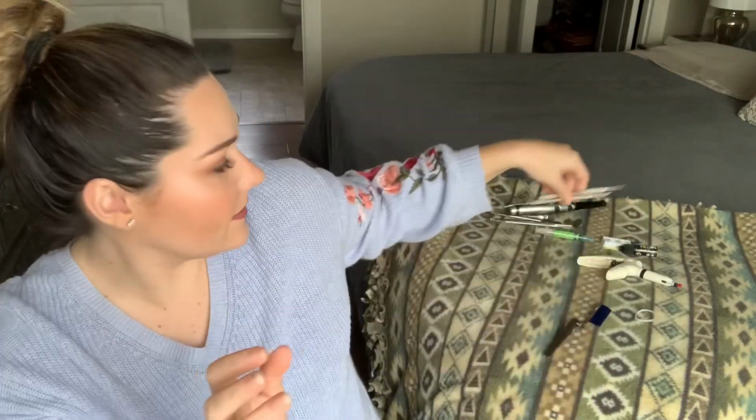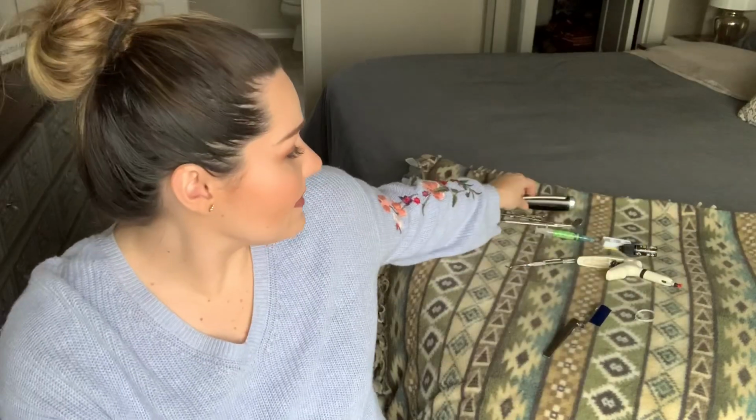So once he has that in there, you're gonna cure it. So again, you're going to cure the composite in there. And if it's a large filling, they may do a couple of layers of composite. So you may have to give this back to him so he can squirt some more composite in there, and then give him his tool of choice so he can push it in there. And then you're gonna have to cure it again at the end. And you cure composite for 20 seconds. That should be your setting on your curing light, so 20 seconds.